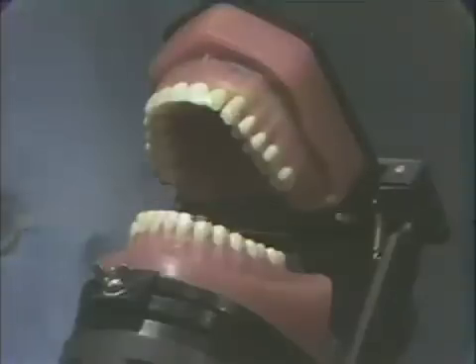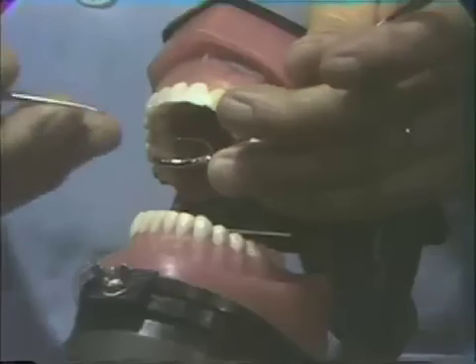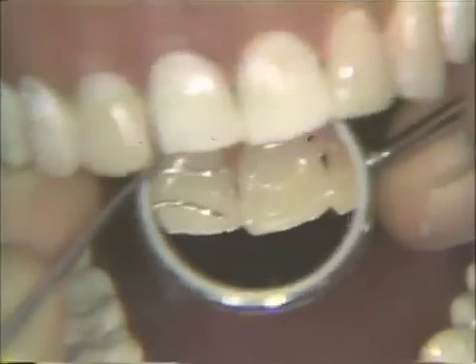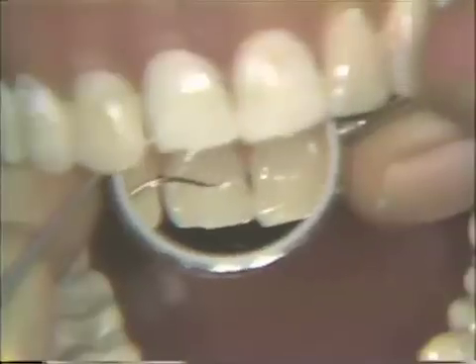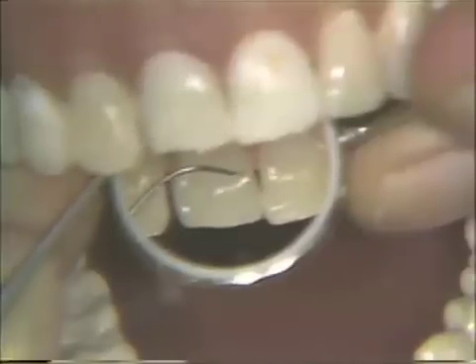We will be doing a Class 3 composite restoration. First of all, we will inspect the lesion with the mirror to find out the exact extent of it in the mouth. If you notice, you can see a grayish area, grayish tan area, and we're outlining it with the explorer.